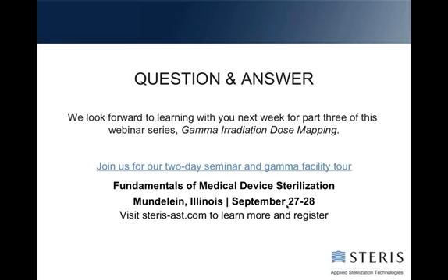There's not a specific value, but there is a rule of thumb. If you have a recovery efficiency of less than 50%, it is recommended that you repeat the test or use a different test method. Maybe improve the method, or for example, if you were doing exhaustive rinse, maybe go to inoculated. The reason for that is, think about what's happening. If you have a 50% recovery, you are automatically going to double your bioburden number.